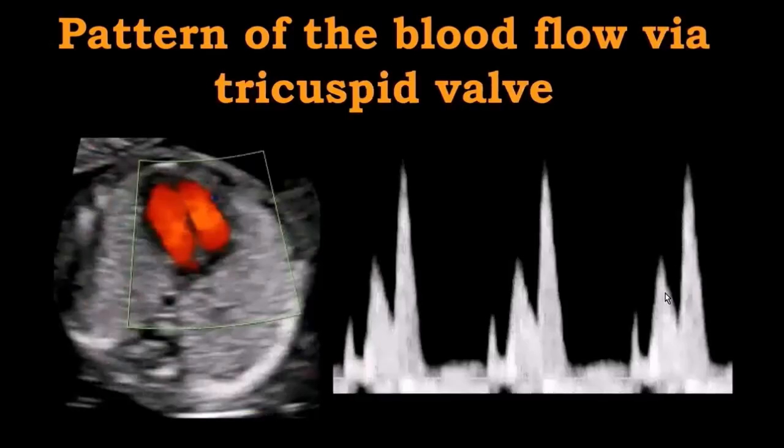And finally, we can take a look at the heart, visualize the four-chamber view directly, and even measure the pattern of the blood flow across the tricuspid valve. Here you can see how in early gestation the blood flow across the tricuspid valve has a biphasic appearance.